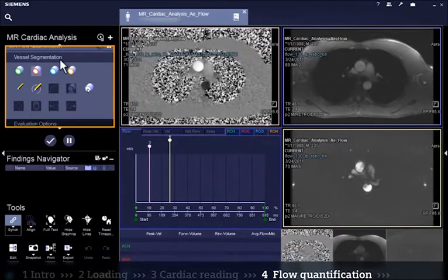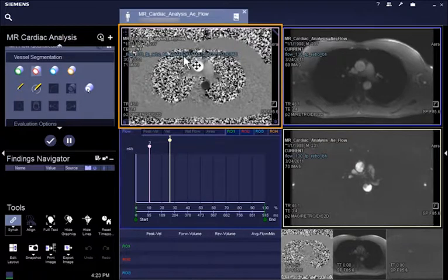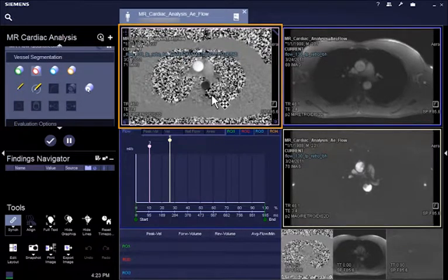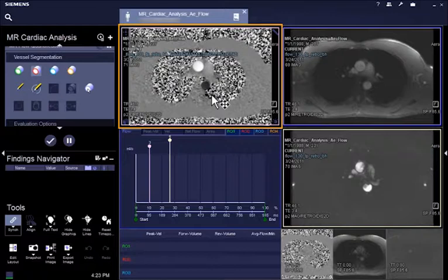The flow quantification step provides the tools for quantitative evaluation of the flow series. All relevant series should be automatically loaded in the respective segments. If this is not the case, a manual drag and drop will allow you to start processing.